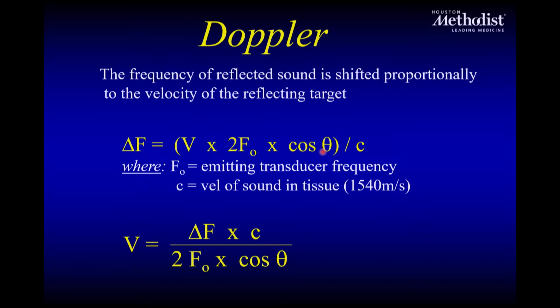As opposed to imaging, remember the imaging said the best visualization is perpendicular to the structure for axial resolution. An example of that is the interatrial septum. If I image it from the apical window, at times I may not see that it even exists. But my best imaging for the interatrial septum is subcostal because I'm perpendicular to it, or RV inflow. As opposed to Doppler, where I would like to be as parallel as possible, because the more angulation I have, the more underestimation I will have of the frequency shift. You got it? All right.